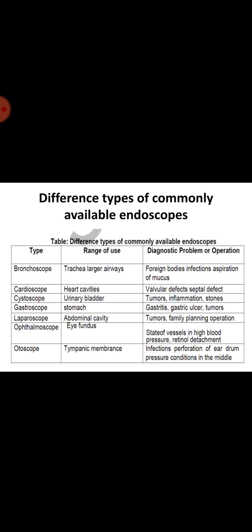For many types of endoscopy, the individual needs to fast for around 12 hours, though this varies based on the type. For procedures investigating the gut, laxatives may be taken the night before to clear the system. A doctor will carry out an examination before the endoscopy. It is important to mention all current medications and any previous procedures. The procedure will depend to some extent on the reason for the endoscopy.